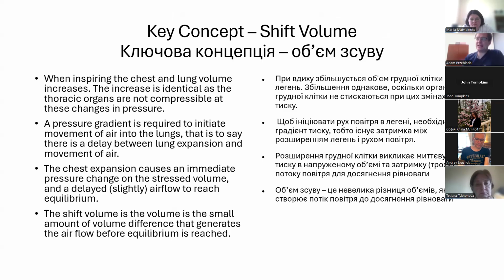And the key concept to understand and tie this together is that of the shift volume. And as I said before, when you are taking a breath in, the chest and lung volume increases.